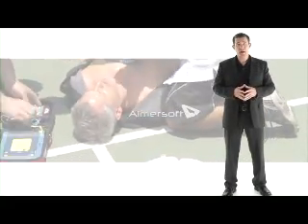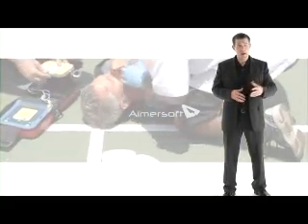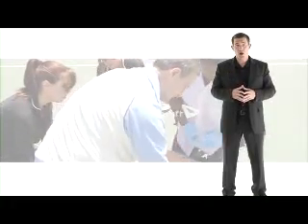Place the AED near the victim's head. Power on the AED. Some will turn on automatically when you lift the cover. Open pads cartridge. Follow AED prompts to attach pads to victim's bare skin. Pads have diagrams for placement. Look at the pictures on the pads.